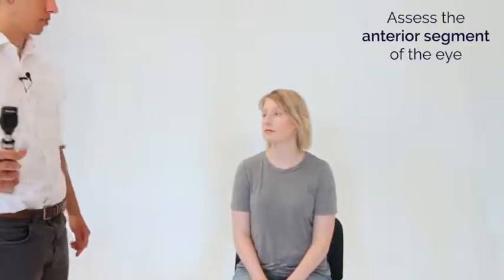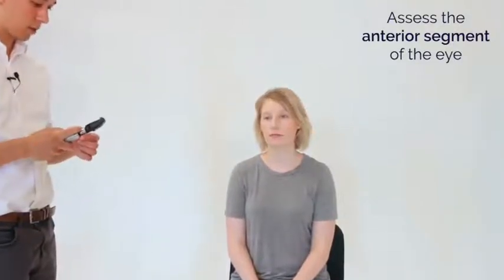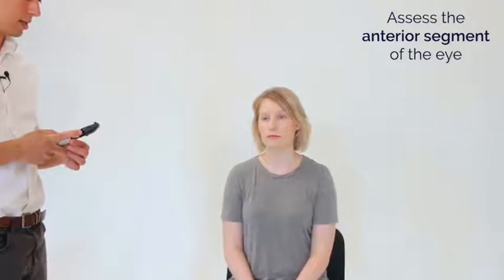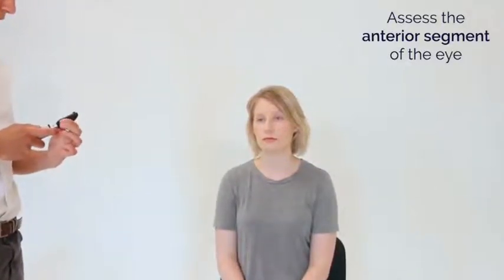Okay, Grace, I'm going to have a closer look at your eyes now with this machine here. If you could have a look for me in the distance over there, perhaps at the light switch. Okay. I'm going to come closer and there's going to be a bright light. I'll pop a hand on your shoulder so that we don't bump into each other.